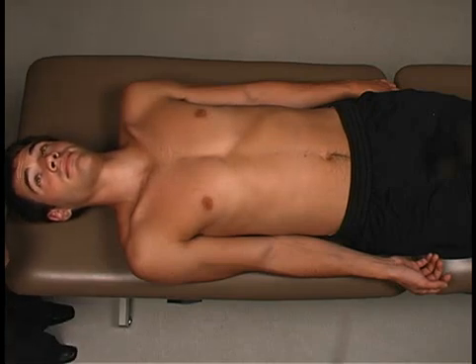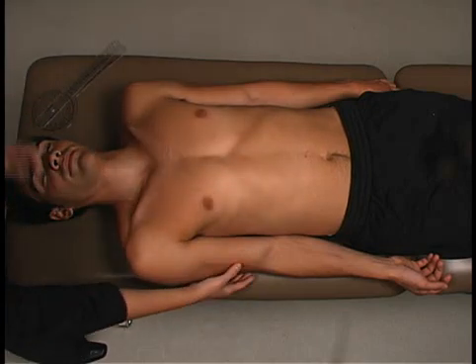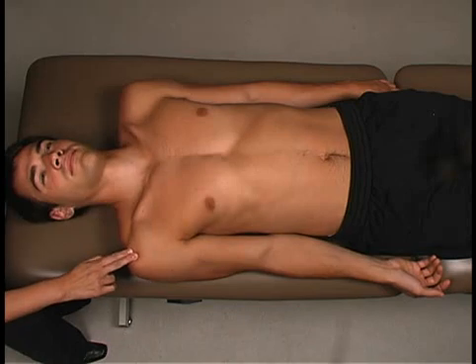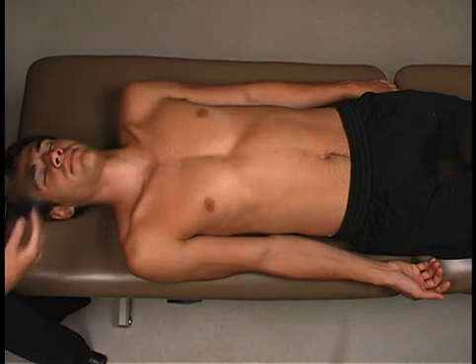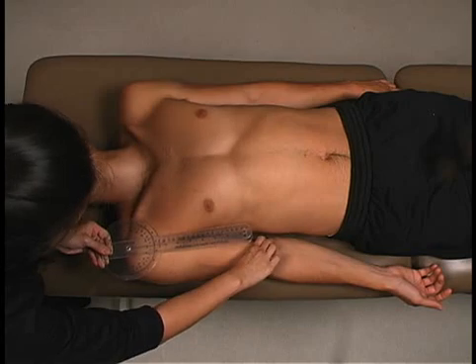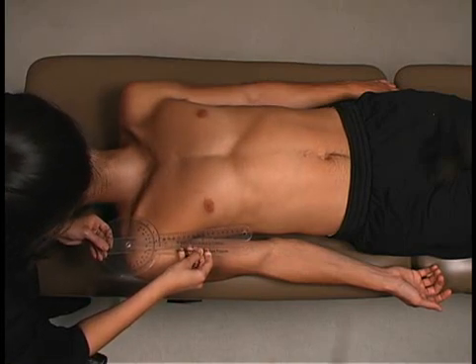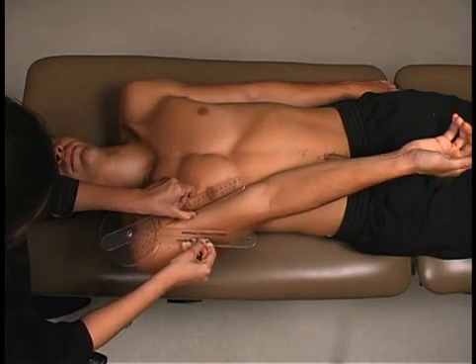Mr. Barnes, I'm going to measure how much you can move your shoulder using this device. When I ask you to, I want you to move your arm across your chest like this and hold it there. Now move your arm across your chest — hold it there.